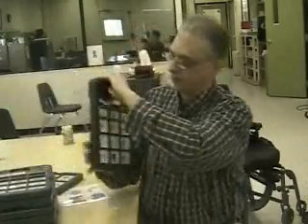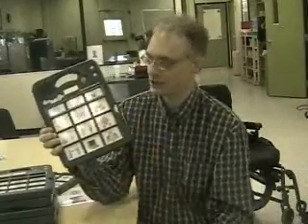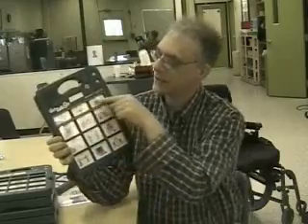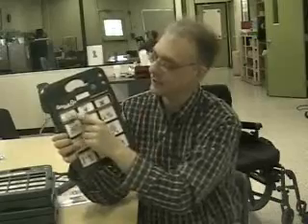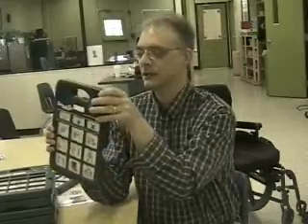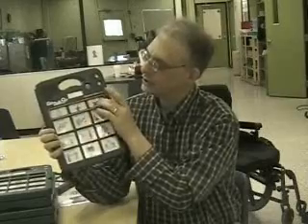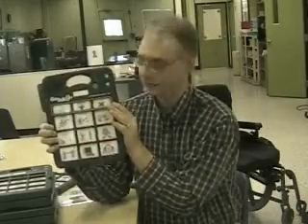I have right here, this is a GoTalk 9 Plus, okay, and so I can get a few more expressions on here. I still have the plus, only this time instead of 2, I have 3, so I have yes, no, and I don't know.